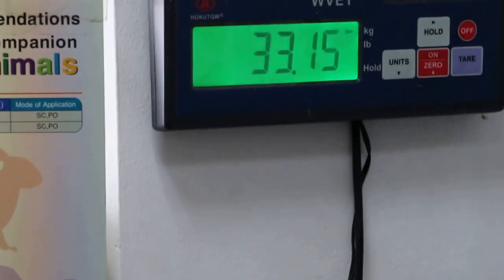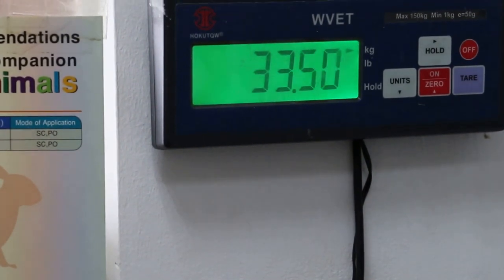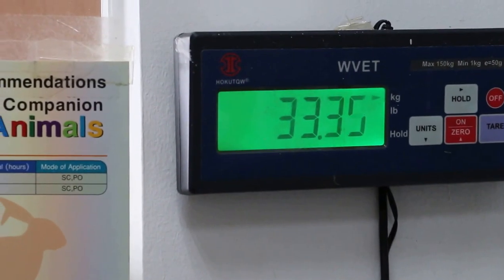And then after that, we do the temperature. Just to show the temperature taking. Okay, finish, just get the footage.